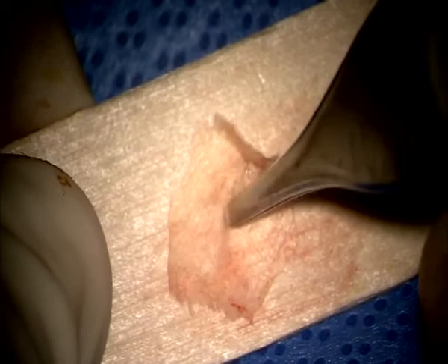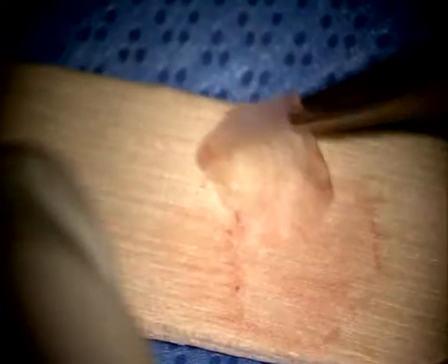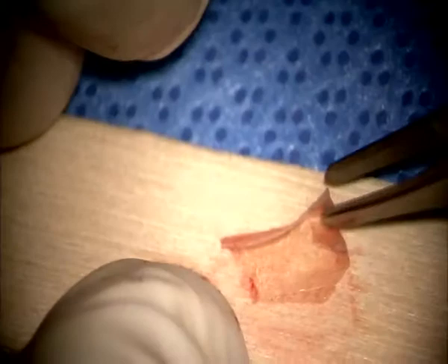So try to make a bit of a gutter like this, and so this is what you got, and then fold it another fold just to get it inside the ear. And you'll see how it goes. Okay, take it. Give me the other one, take it.